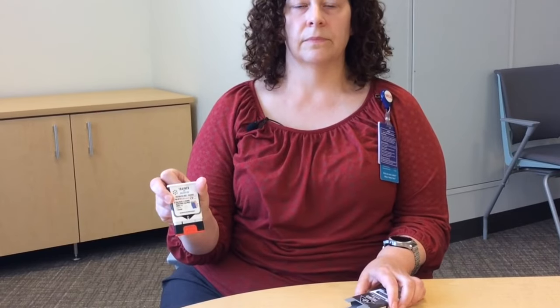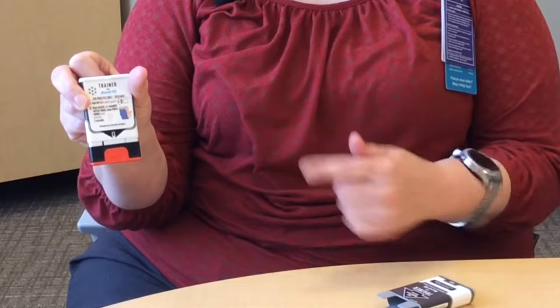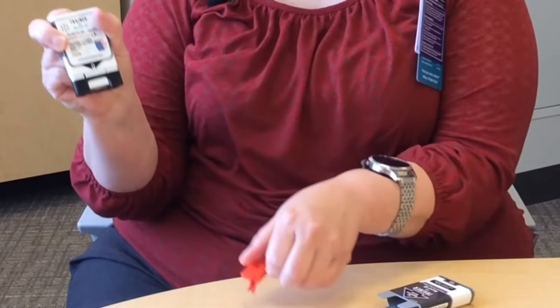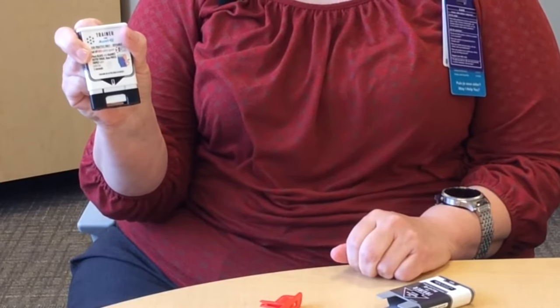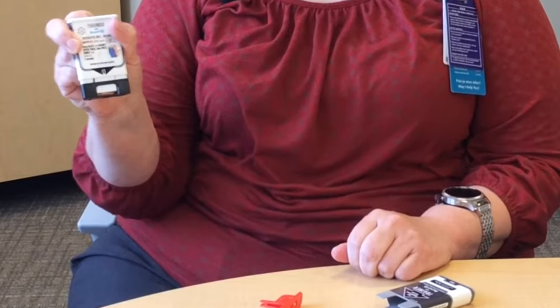Remove the auto-injector from its outer case. This trainer contains no needle or drug. You are ready to use. Pull off red safety guard. To inject, place black end against outer thigh, then press firmly and hold in place for five seconds.